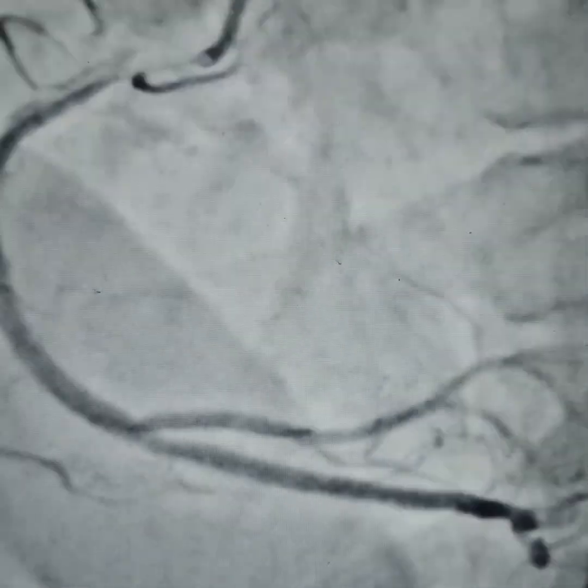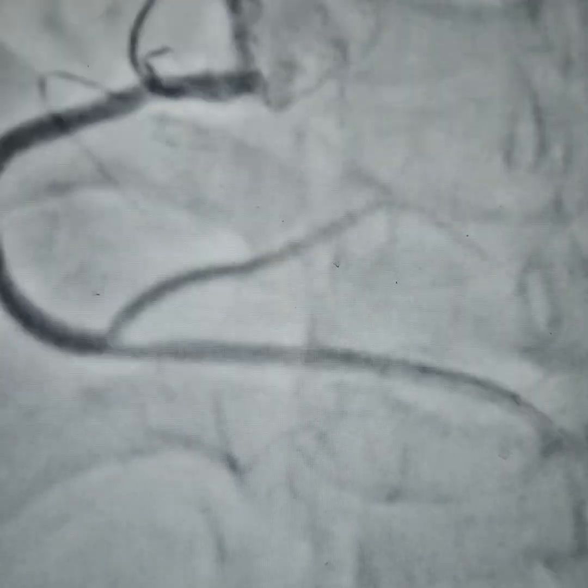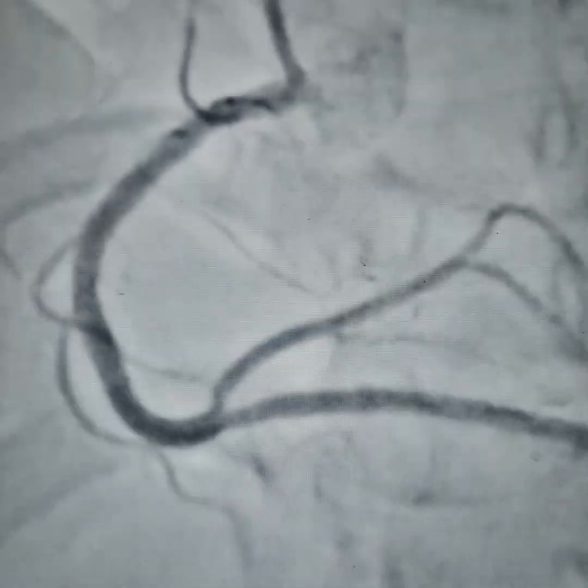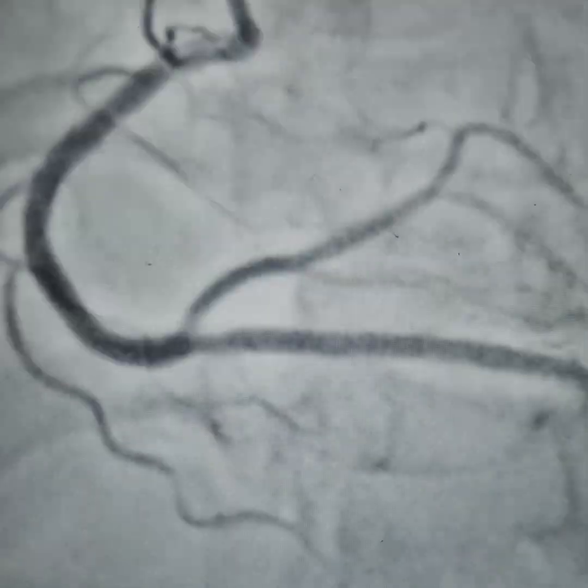And it has been opened in a wonderful way, and you can see a good result throughout. And yeah, so hopefully for the next 5 to 10 years the stent is also going to work, and maybe even more than that, hopefully.